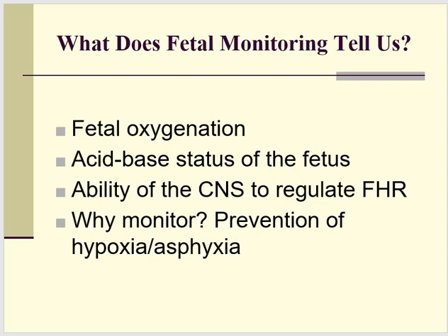Part of the challenge of fetal heart rate monitoring is that very small changes in pH may cause significant damage in fetal function and outcome. However, not every baby reacts in the same way. Some babies have more of a buffer system than others.